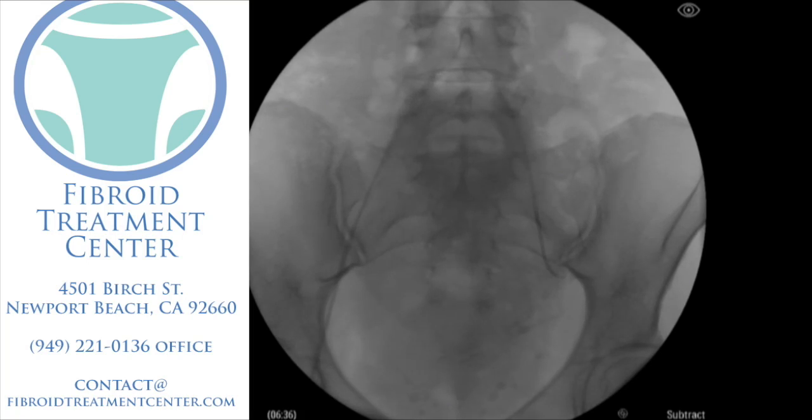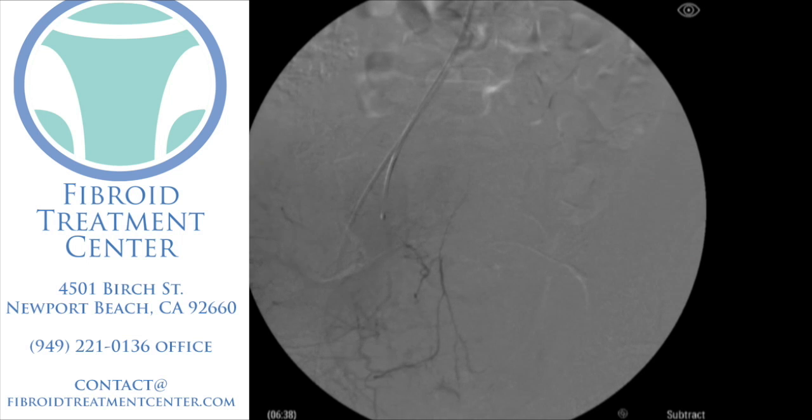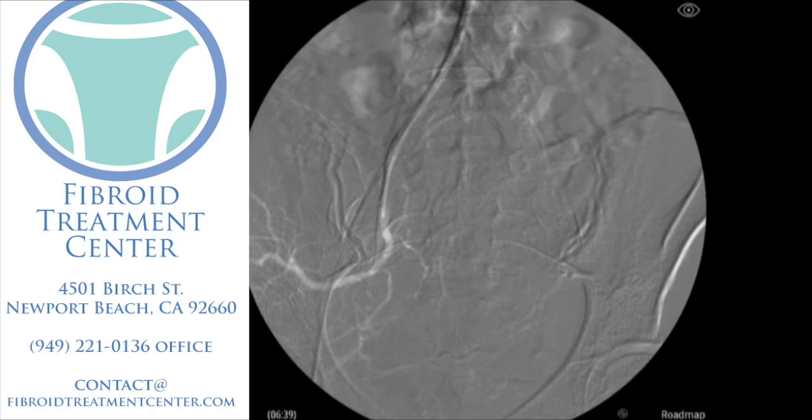We're going to readjust the catheter and now try to find the artery on the right side of the pelvis that's feeding the remaining portion of the fibroid. Again, we're using the wire and that catheter, spinning them around to get in the correct position. We're going to bring it down into the right pelvis, take the wire out, and do an x-ray to see where the uterine artery is. We're going to advance the wire, similar to the way we did on the left side, and use that little roadmap to advance the wire into the right uterine artery, which is feeding the right side of the fibroids.